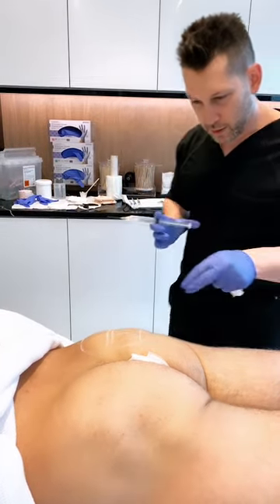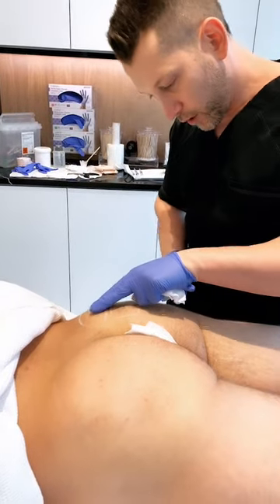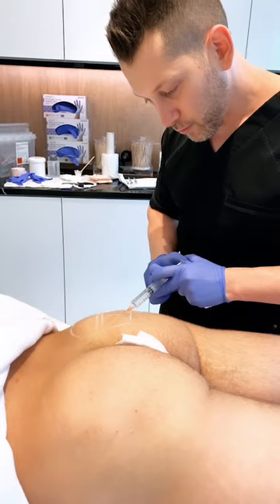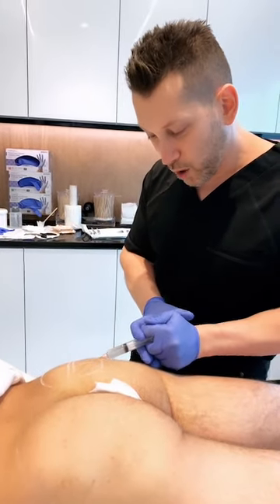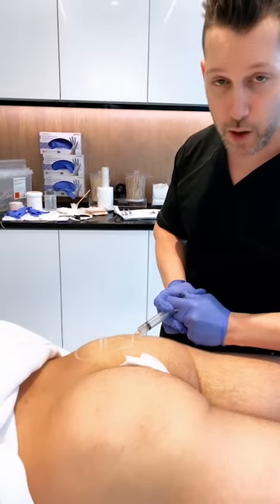Squeeze as hard as you can. Perfect. I just want to see the roundness. You guys can see there. Good, relax. We're going to keep building a little bit in this upper portion here. And that's it. Then we're going to wait a few months and see how it builds with this working out. So that is Sculptra non-surgical buttock augmentation.